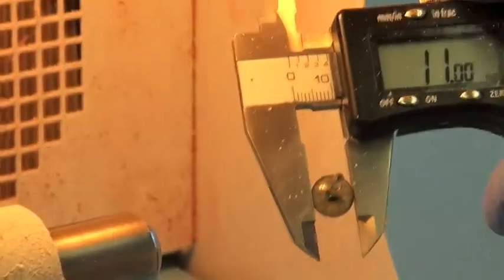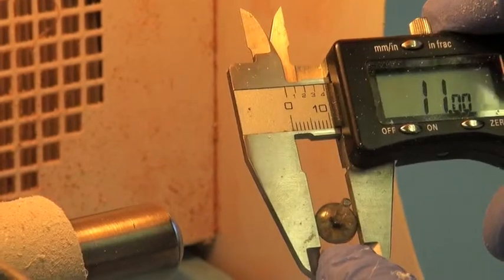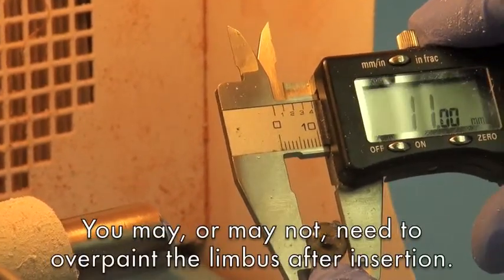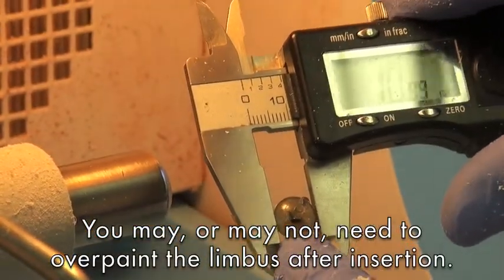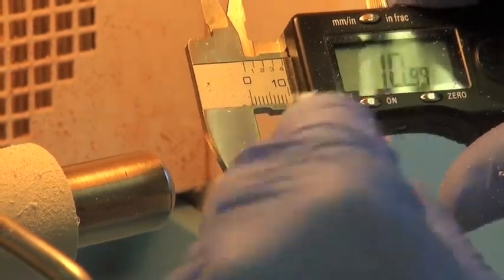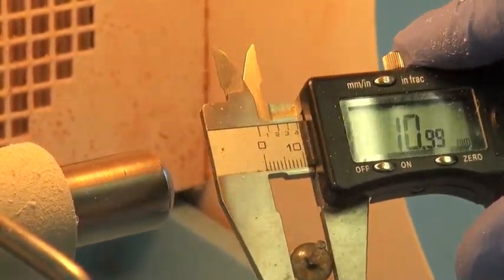Let's measure and see where we're at. That is an exact 11.0 diameter. And you can still see just a little bit of a limbus on here, which might be perfect in this case. Sometimes you may need to paint that on afterwards if you have a thick limbus or something like that.